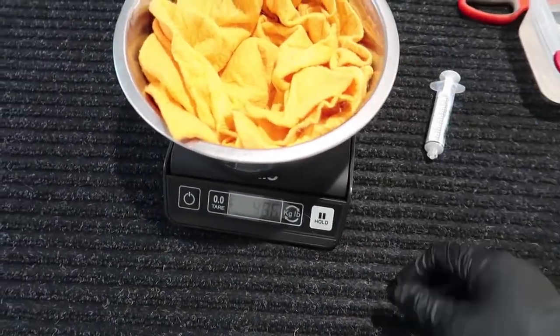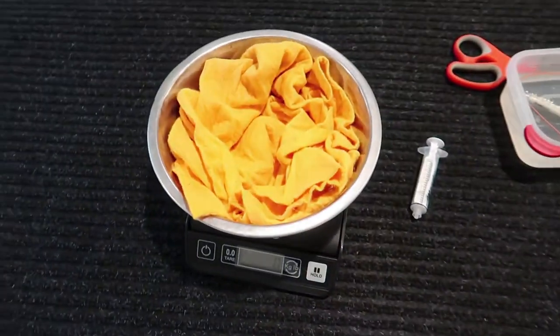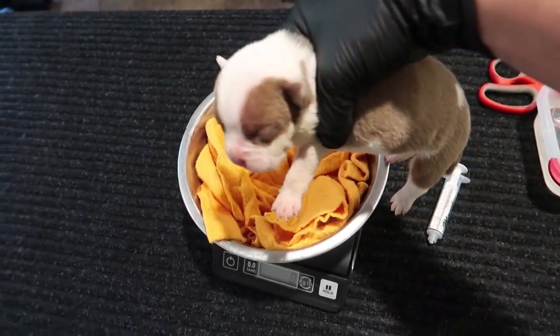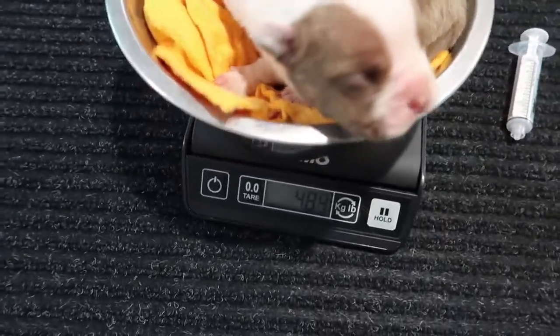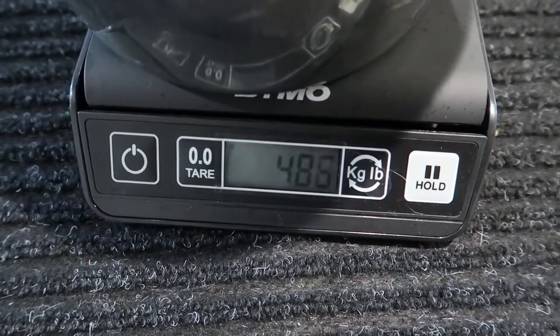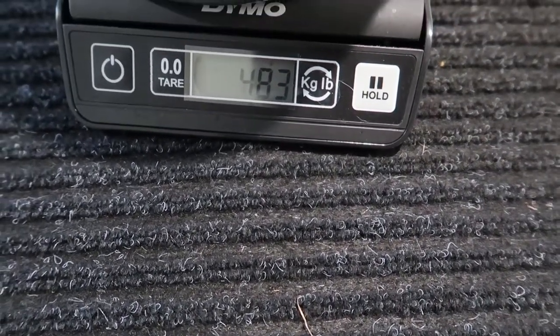We'll put this here and zero it out. Then we put the puppy on there. This is one of my runt puppies, so we'll feed this one. This one weighs about 480 grams.